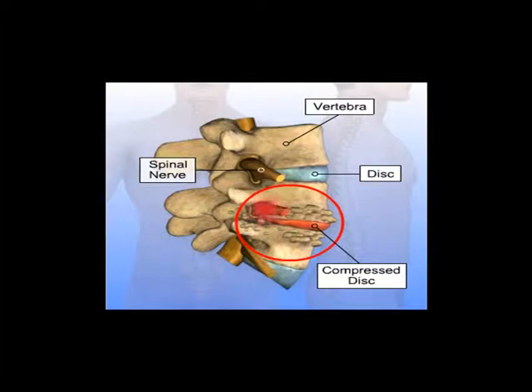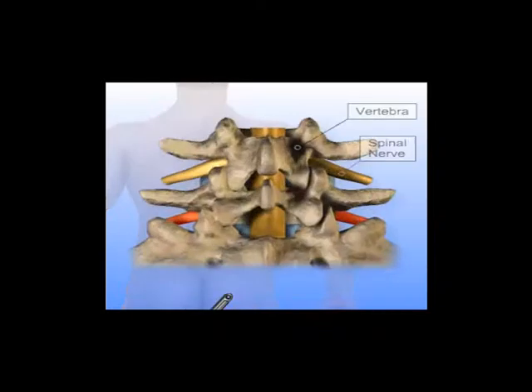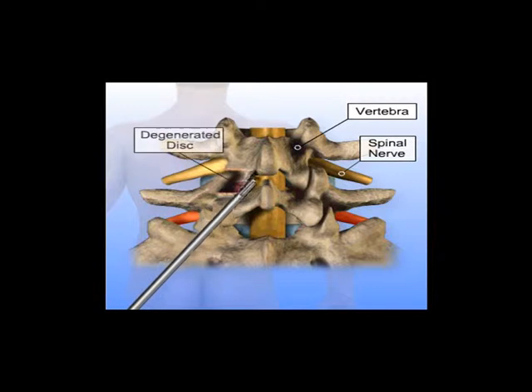An incision is made in the middle of the low back. Surgical instruments are used to remove the entire facet joint on one side in order to allow access to the degenerated disc. A grasping instrument is used to remove most of the intervertebral disc. Removing the facet joint and disc relieves pressure on the compressed spinal nerve, allowing it to return to the proper position.